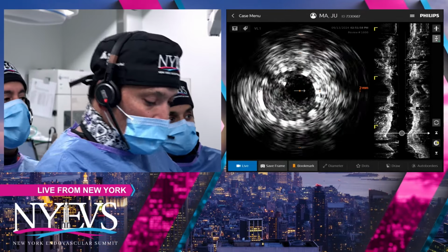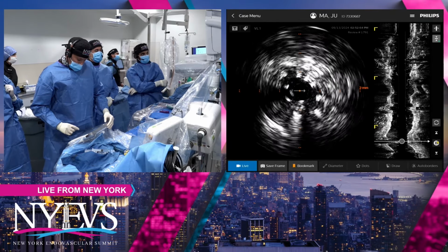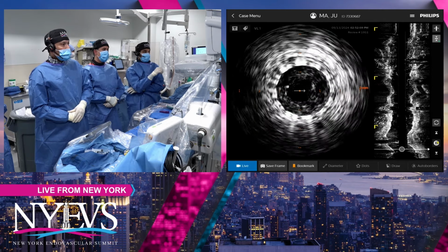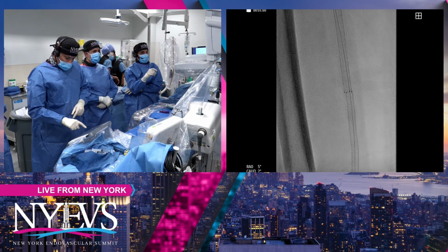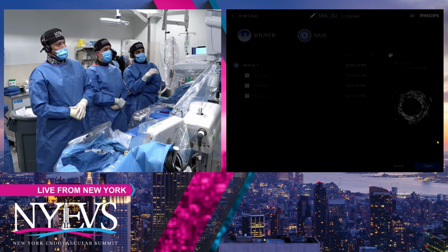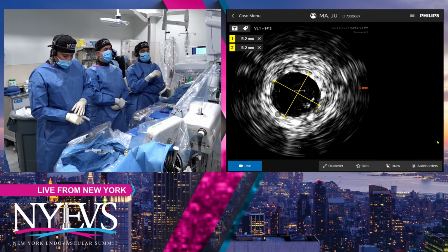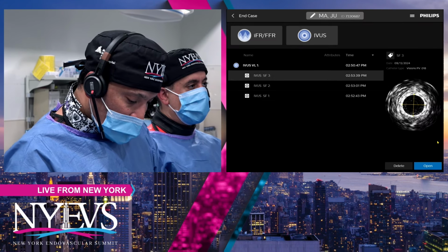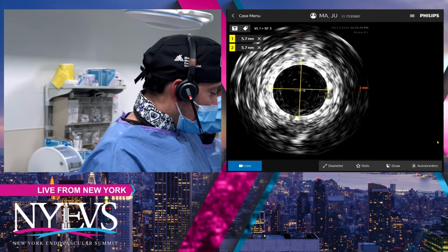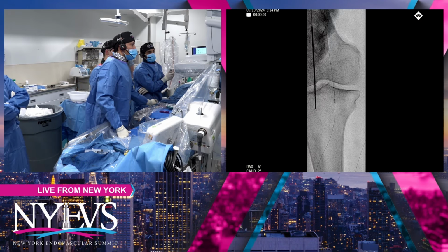Yeah, but the Supera and all the stent, as you can see, it looks very well deployed. There's no obvious sign of fracture or anything. Yep. Yeah, the only sign that we do see is just at this one segment of the overlap. Yep. Which, if we can show the actual angiogram, it's a notable point. So once we come after this, I'll show you exactly how the stent sizes are. So if you see, this is a Supera stent size. Seems to be deployed pretty fine. Looks like a 5.5 Supera. Diameter seems 5.2. And then this is the 6.0 Silver PTX, which they put. Seems 5.7. So it seems pretty okay. And if Raman is going to go to the one before this, fluoro, Raman.